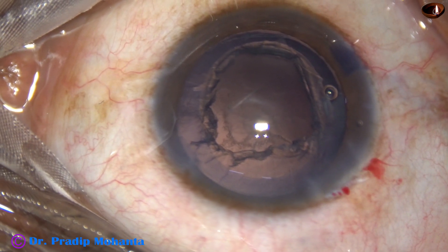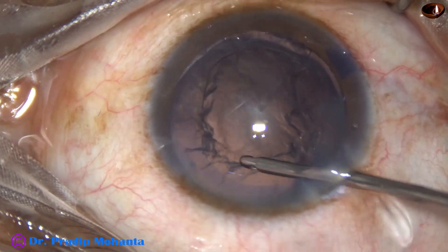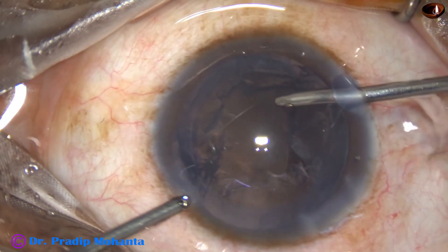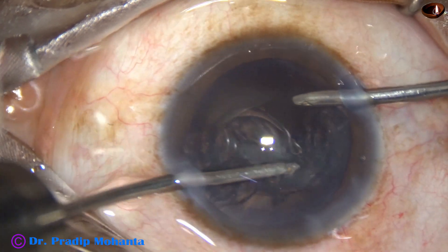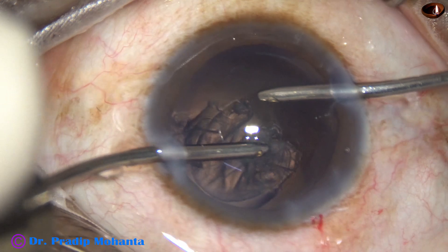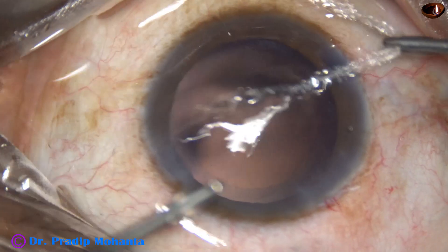Now we have to remove the cortex. There is a lot of cortex. I am hydrating the cortex using an irrigating probe first, so that I can easily pull the cortex to the center. At this time, the vacuum is 300 and flow rate is 30. The cortex is being nicely removed. Irrigation is through the right side port and aspiration is through the left side port.